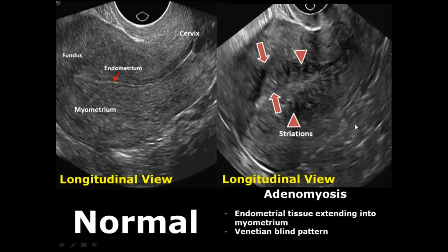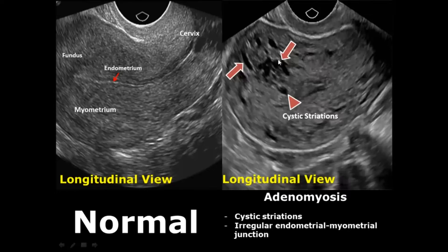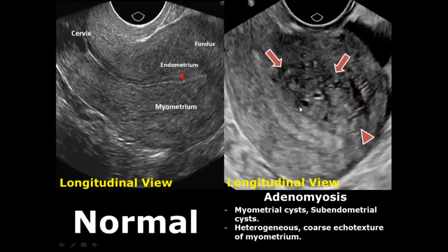Adenomyosis is the presence of endometrial tissue within the myometrium. It has a typical appearance called the Venetian blind pattern, which has alternate bright and dark bands present in the myometrial area. It can also have cystic striations as well as an irregular endometrial and myometrial junction. Myometrial cysts and subendometrial cysts can also be seen.